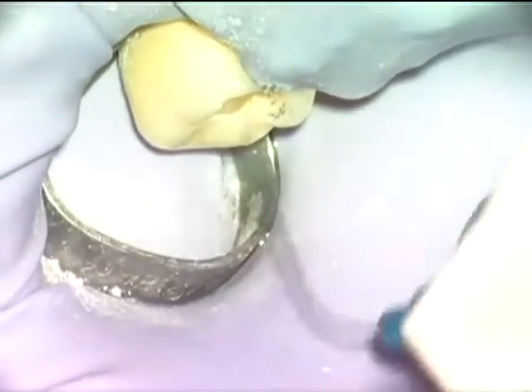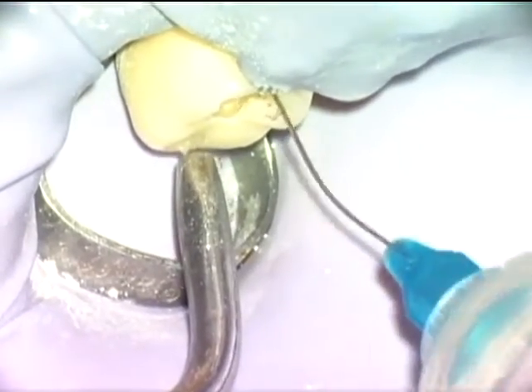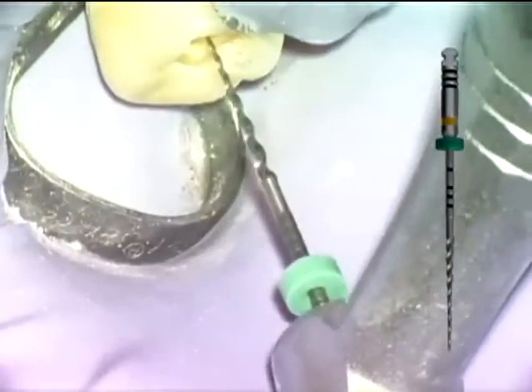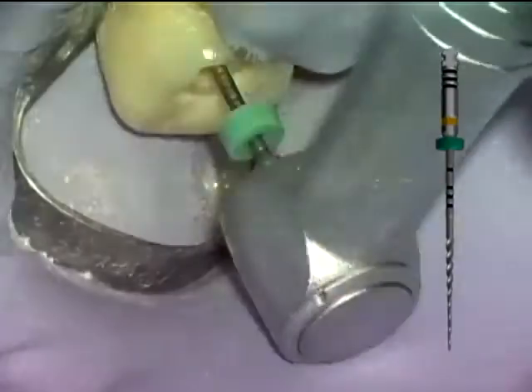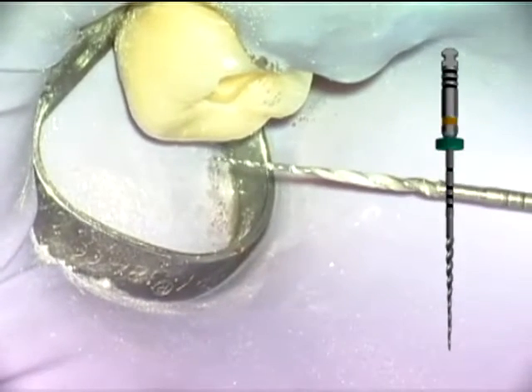All of the canals are again irrigated with sodium hypochlorite prior to beginning shape in the mesiobuccal canal with the 2006 GTX file. Two cutting cycles are accomplished with the same appearance of the tip flutes in the 2006, indicating the need for a 30 series GTX file to finish this shape.